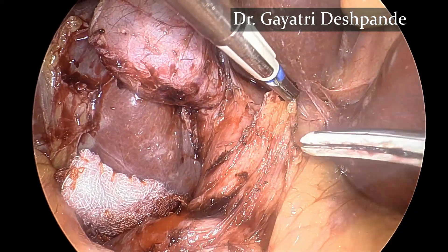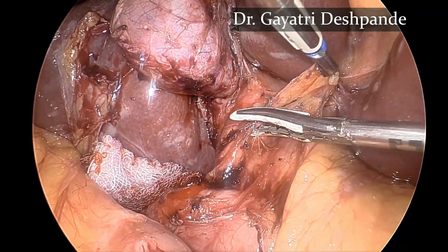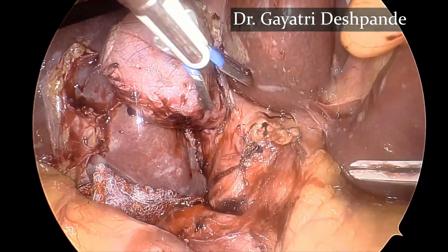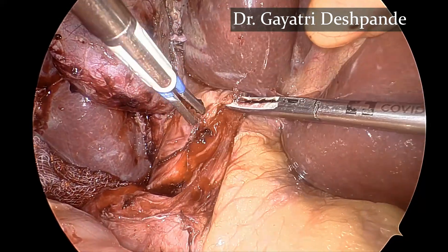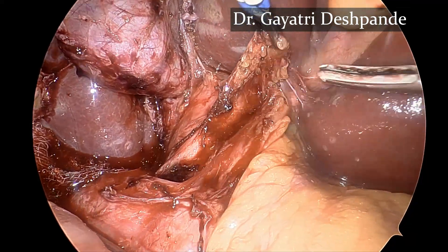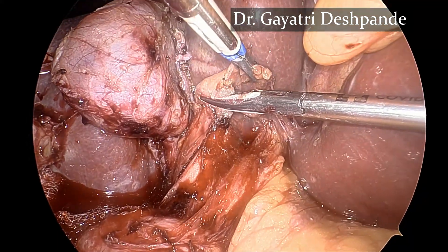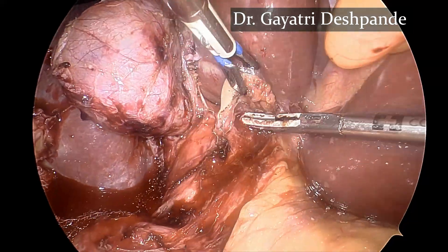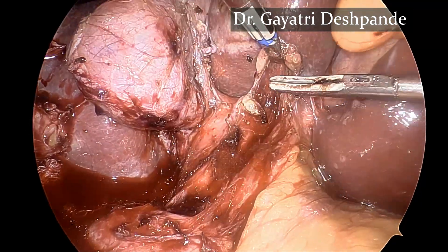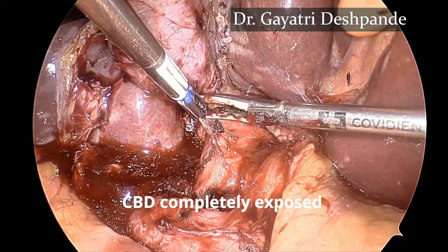Bipolar in one hand and energy source in the other hand is useful for bloodless dissection. The peritoneum over the common duct is completely mobilized so that the bile duct comes into view. It is important to completely skeletonize and expose the common duct before it is opened.